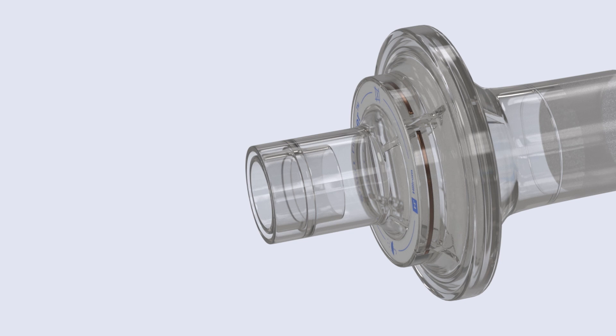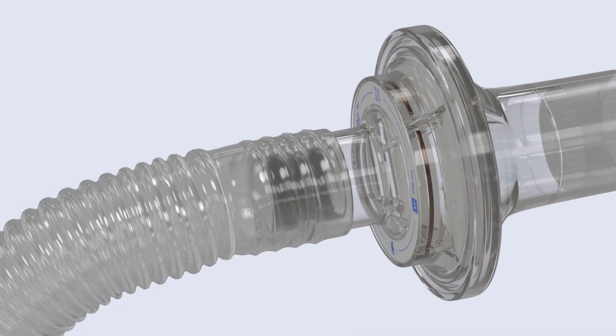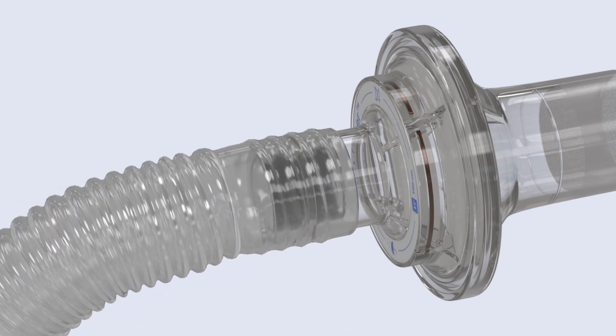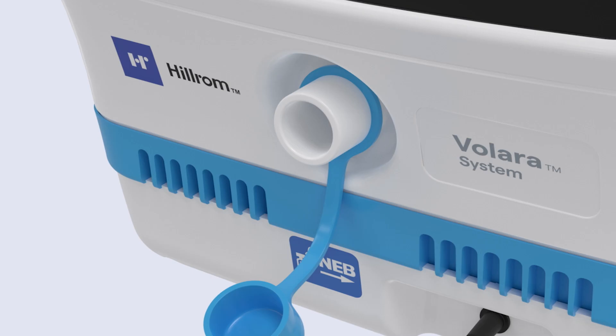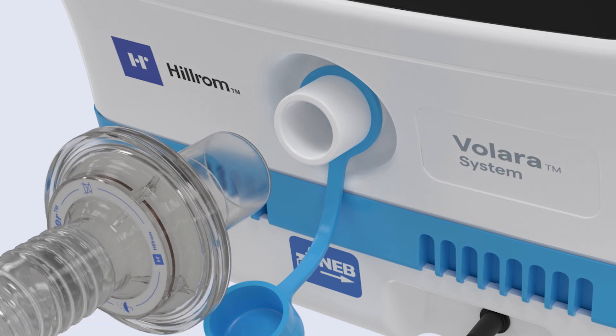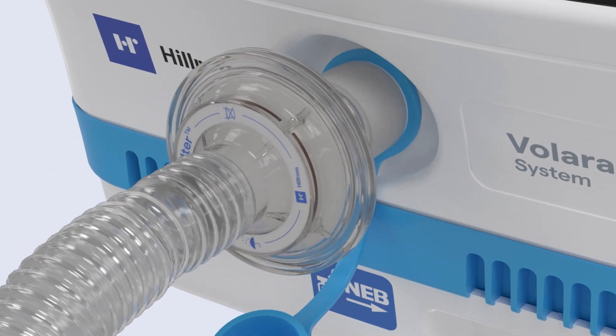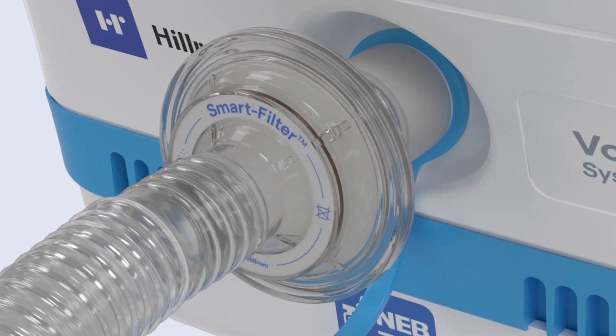Confirm the connection of the breathing hose to the smaller end of the smart filter. Then align the larger end of the smart filter with the therapy port, gently turning to secure.